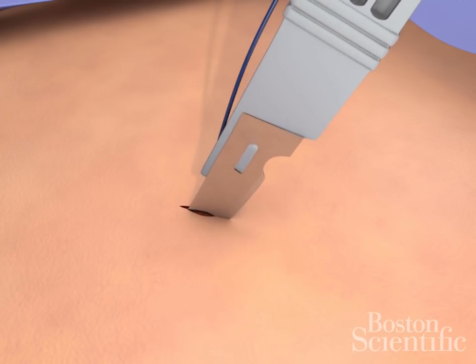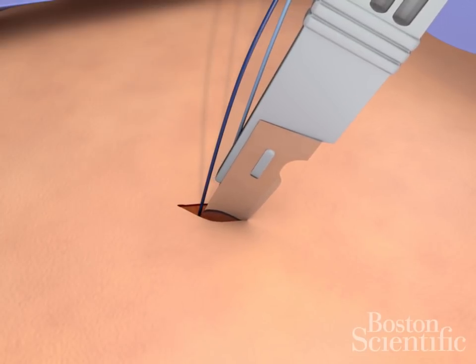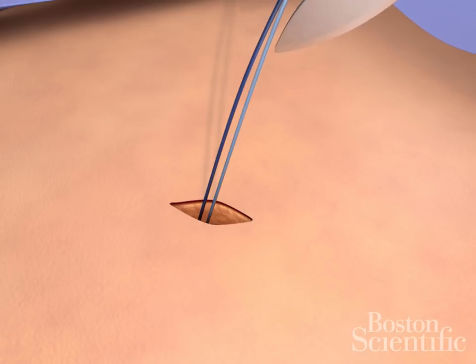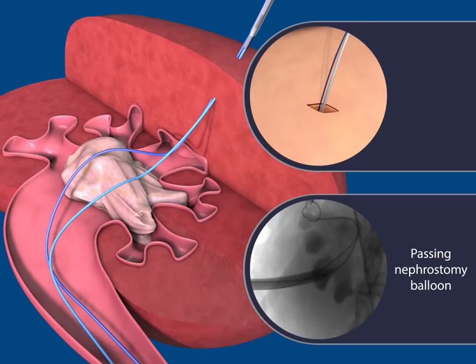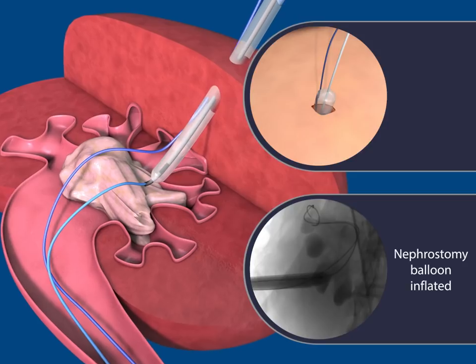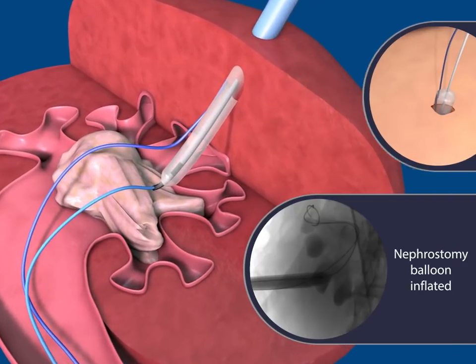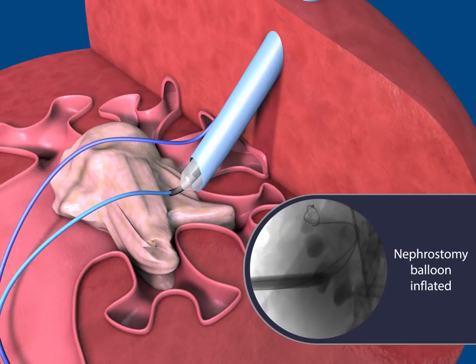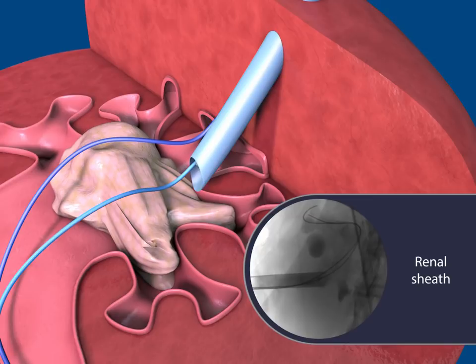Incise the skin in the back through the connective tissue in order to widen the existing puncture. Slide the balloon catheter over the stiff wire up to the stone. Inflate the balloon to the appropriate pressure. Slowly insert the renal sheath, twisting clockwise and counterclockwise until reaching the stone. Deflate and remove the balloon catheter. Both wires remain in place.